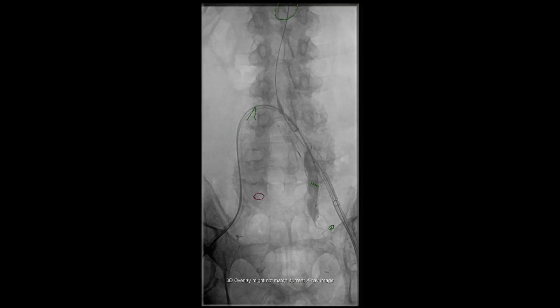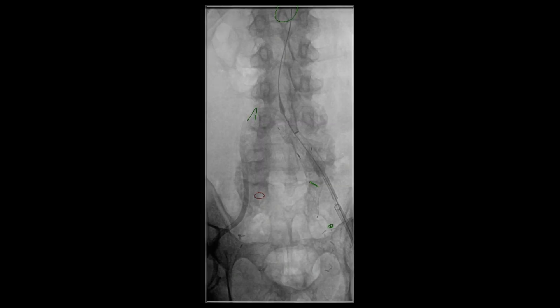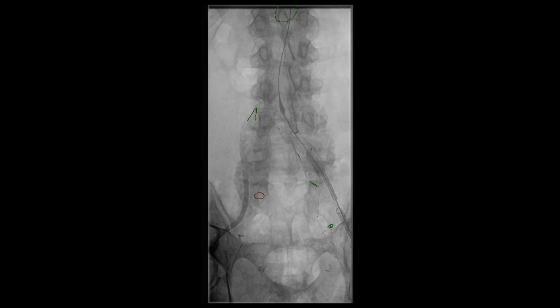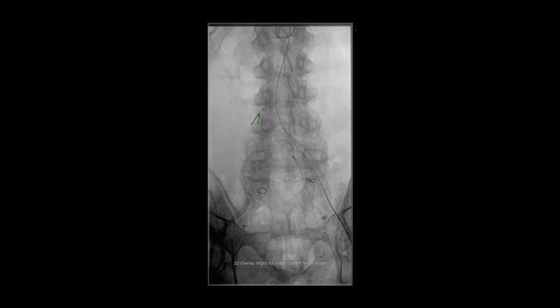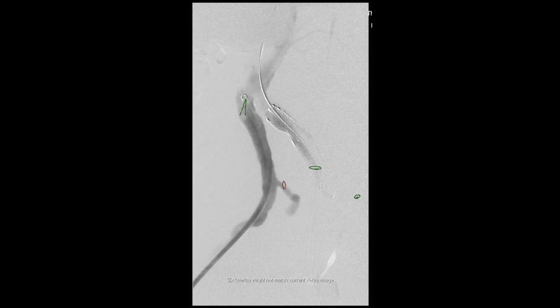An angiogram is then performed to confirm good blood flow to the internal iliac artery and successful deployment of the stent graft. We then completed our deployment of the left common iliac artery branch device. Balloon angioplasty of the iliac branch device is then performed, followed by another angiogram.